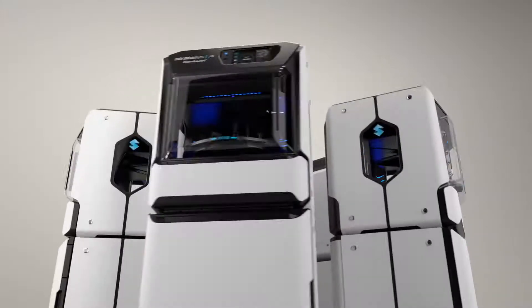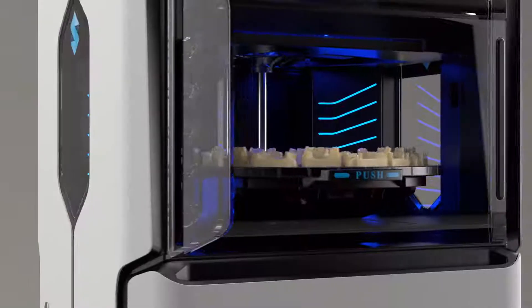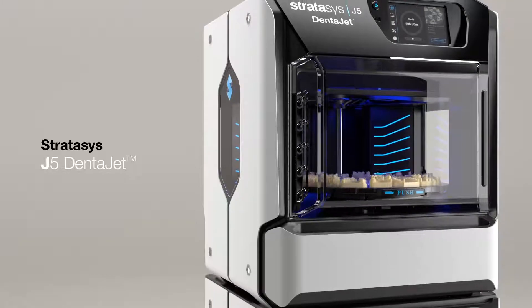All lab types, all in one tray, all of the time. The newest addition to the Stratasys Dental family, the J5 Dentajet is the all-around dental solution.